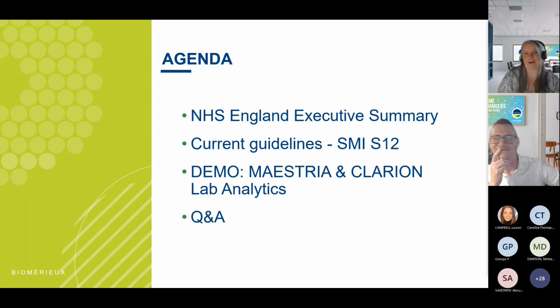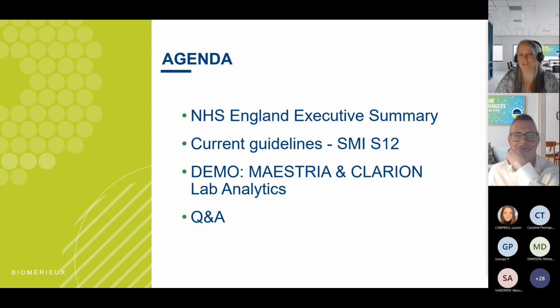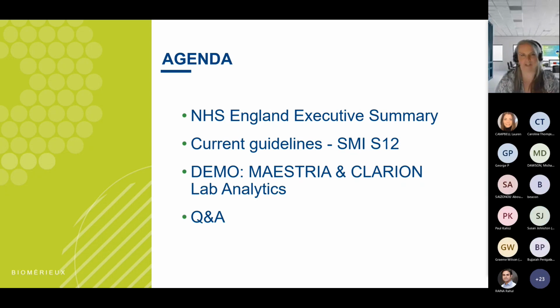So just in terms of an agenda, I'll do a little bit of background in terms of guidelines for blood culture pathway, and then Jamie's going to do the heavy lifting and go through MAESTRIA and CLARION Lab Analytics in more detail, and then demo the middleware. So we also have Lauren, our colleague with us today, who's going to keep an eye on the Q&A. So as we go through the presentation and the demo, if you do have any questions or have any comments, please do put it into the Q&A function. We'll keep an eye on it, and there will be time for some discussion at the end of the presentation.